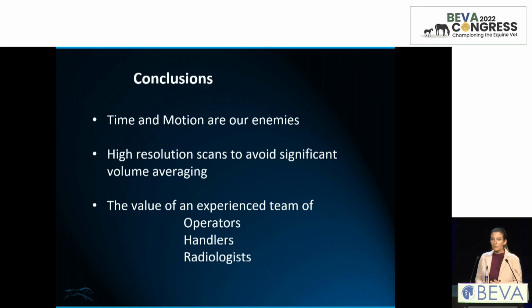So I've been whizzing through it. It seems I'm very hungry myself, but to conclude on this, time and motion are certainly our enemies, but do not shy away from high-resolution scans because you make the radiologist's life really much easier the more anatomic detail we can have. The value of an experienced team of operators, handlers, and potentially the radiologist on site is a really great advantage.